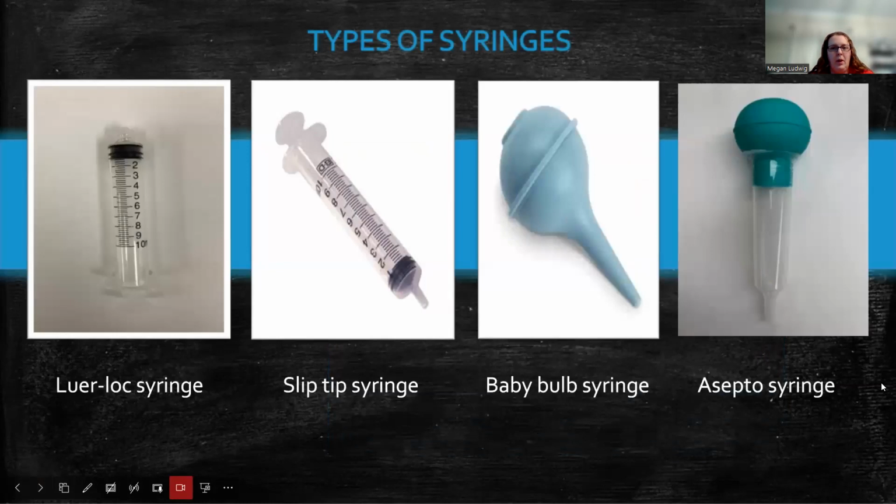So our next supplies are syringes. A lot of different types of syringes, and this really isn't even all of them. There can be variations of really both of these at the beginning here. So the Luer lock syringe is probably the most common. This is what you're going to use to inject your local anesthetics most often at the beginning of cases or at the end of cases for post-op pain control, but they are numbered, okay?